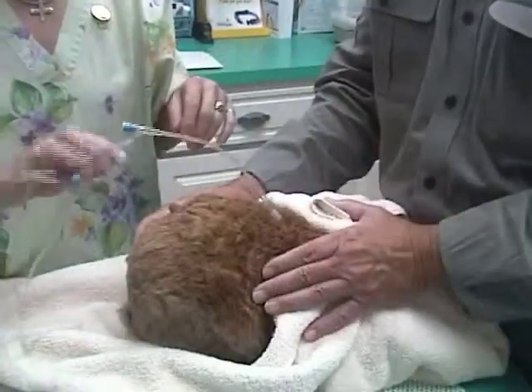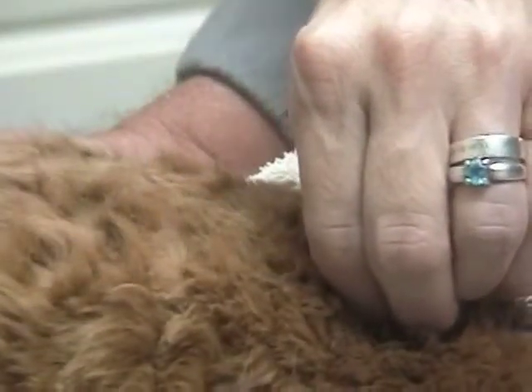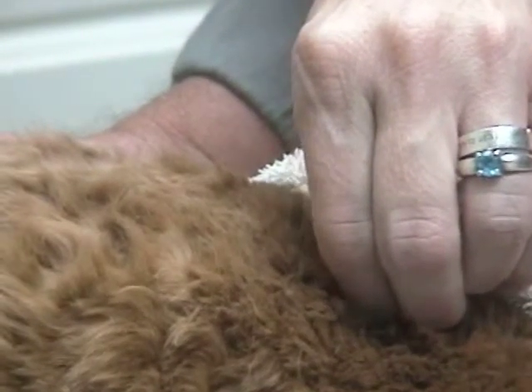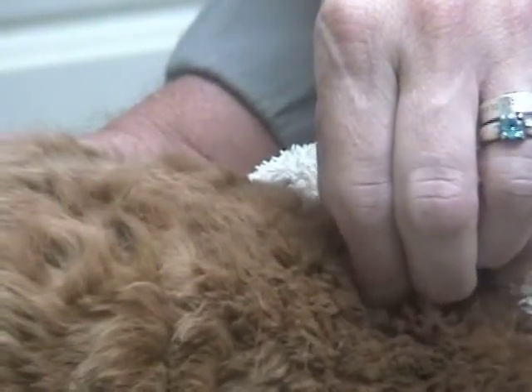She's gotten her fluid, so I've clamped off. You want to pinch where the needle goes into the skin and hold it as you withdraw. And hold it for a moment just to make sure that minimal amount of fluids leak out of the hole that you've made with the needle.